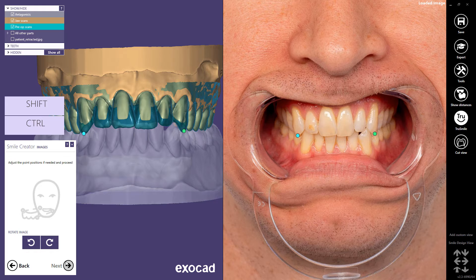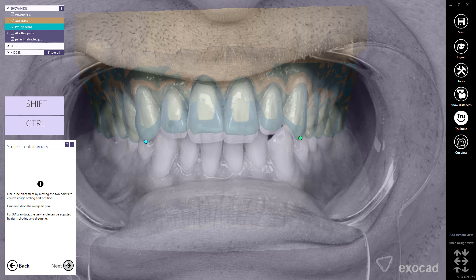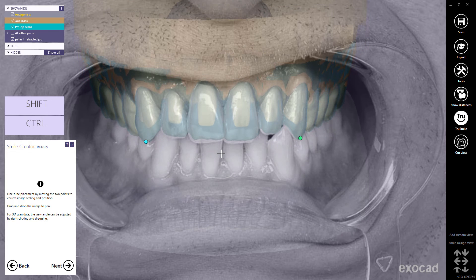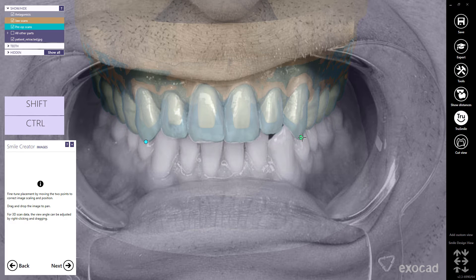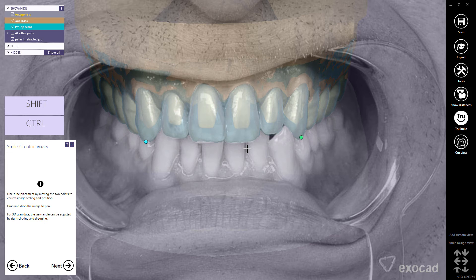Proceed to Next. For 3D scan data, the view angle can be rotated by right-clicking and dragging the mouse. Fine-tune the placement by moving the two points to correct image scaling and position. Drag and drop the image to pan. Note, the accuracy of this placement is not critical and is mainly for aesthetic preview. Proceed to Next.